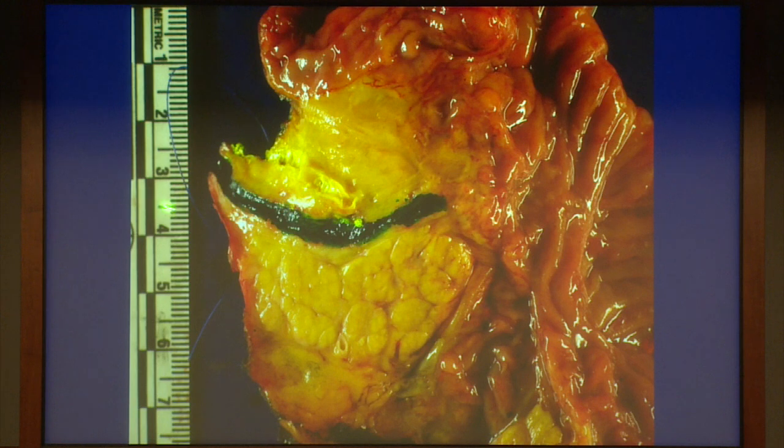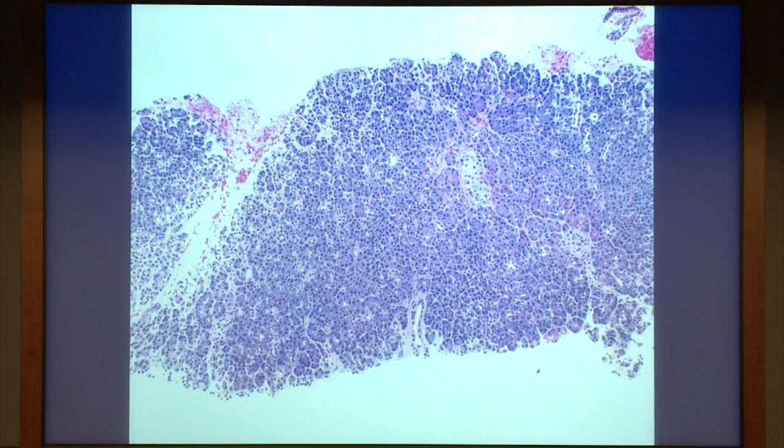So in this portion of pancreas, there's this nodularity. This is all cancer. And notice there's a thin separation between this and the common bile duct. So this is pancreatic adenocarcinoma, and I feel very confident that we can distinguish that from intrapancreatic cholangiocarcinoma.